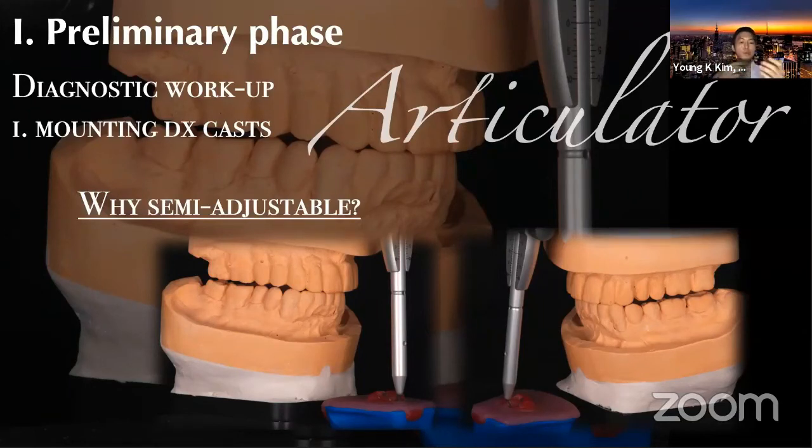So my protocol of utilizing semi-adjustable articulator would be, if you're increasing vertical dimension, we can take the jaw relation at the desired vertical dimension, and then take several protrusive bites, and then evaluate on the articulator, average them out, and we perform the negative error for the horizontal condyle inclination. Then we can test that mutually protected occlusion, whether wax up or interim restorations, and then we can use a custom guide table in the front.